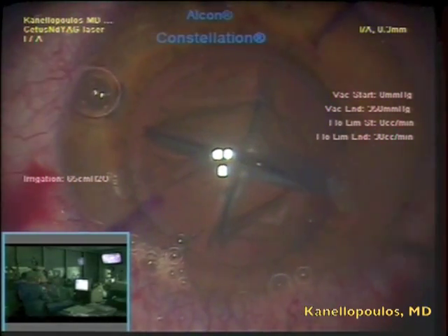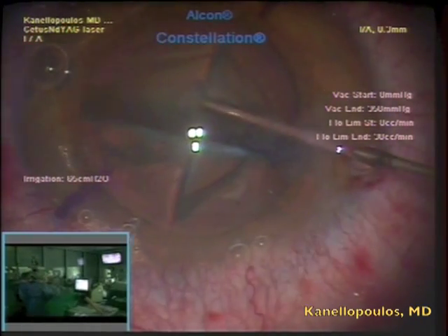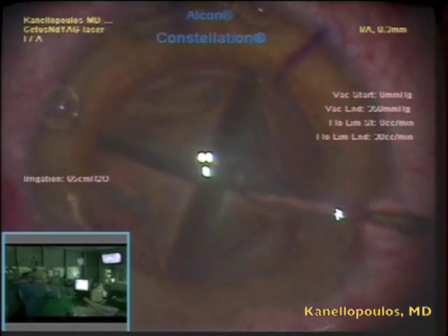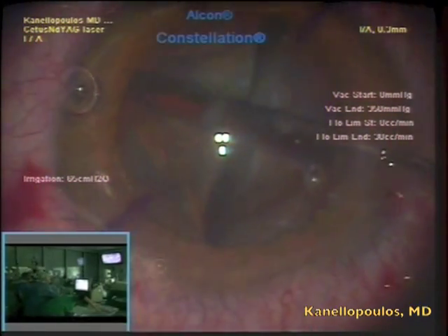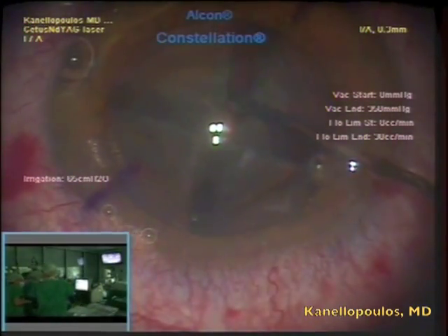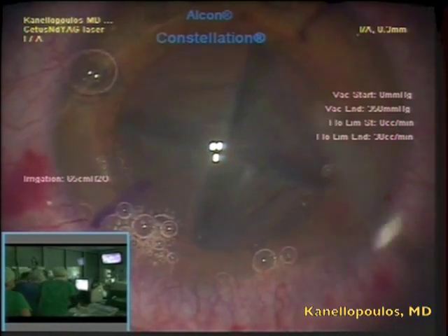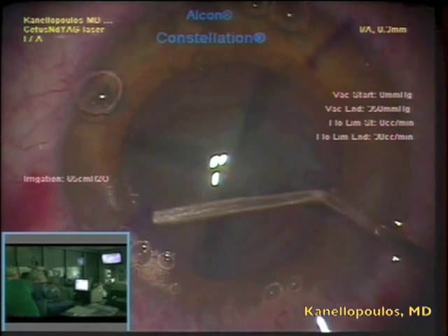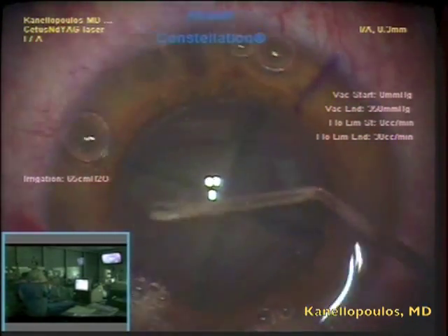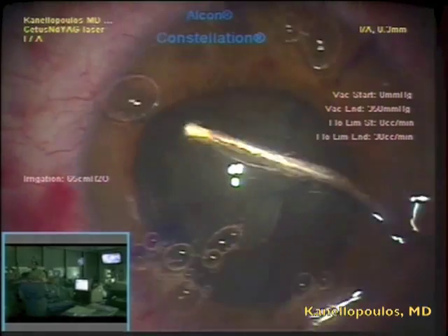I'm using methocellulose to lubricate the interior surface and reduce patient discomfort from splashing drops. Here you see our technique: going in with viscoelastic and completing the lens separation, with it being very anterior, almost under the anterior capsule. So here we're separating the lens into four pieces. This is a medium density cataract. It's kind of rare in practice to see such soft cataracts here in Greece. I'll leave some viscoelastic out to go in and do hydrodissection now after the lens separation. I have no fear of hydrodissecting because the lens has been fragmented in four pieces.